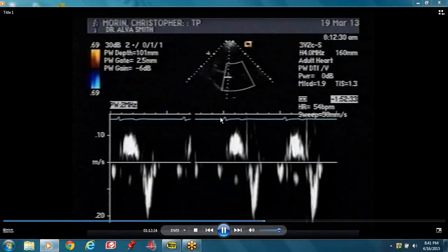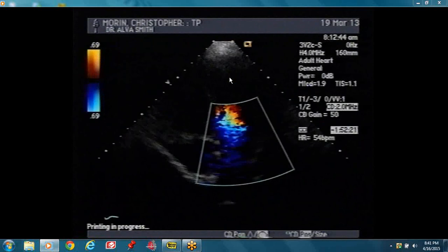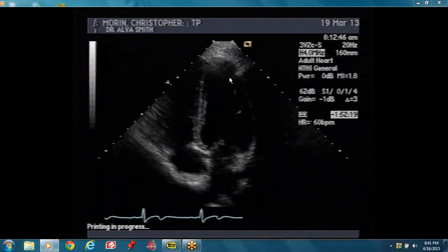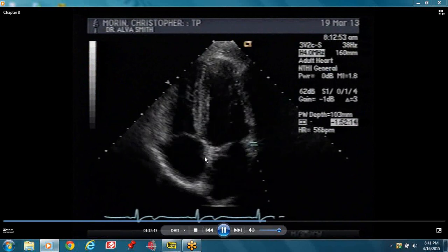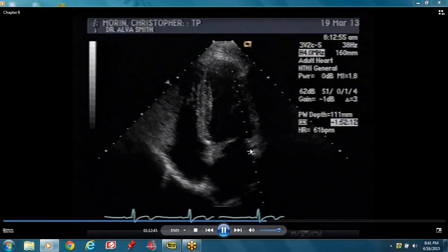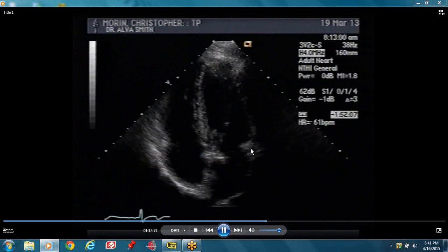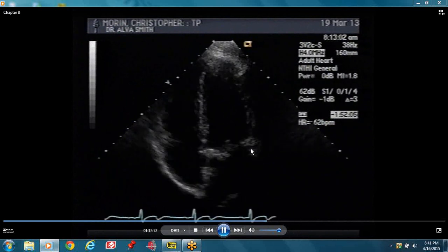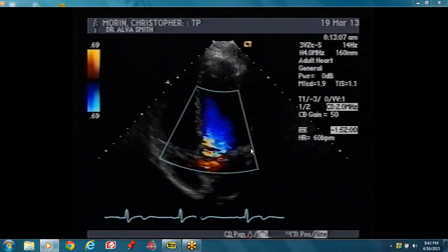The cursor is at the medial annulus and we're looking for the velocity in centimeters per second — not meters per second, but centimeters per second. We do the medial and we do the lateral. The lateral annulus will give you larger velocities.